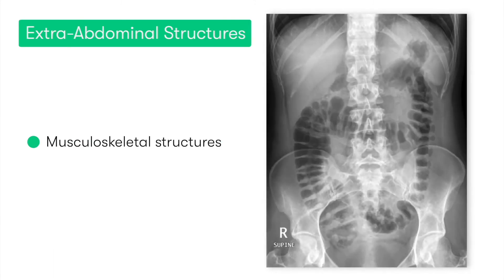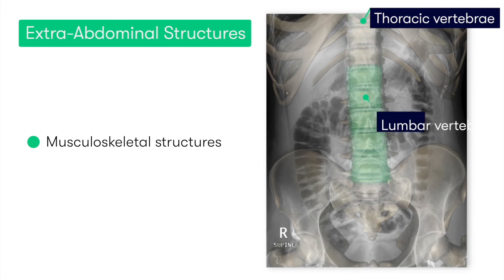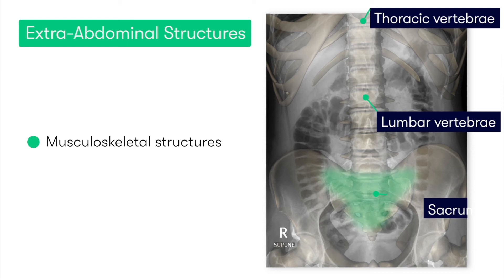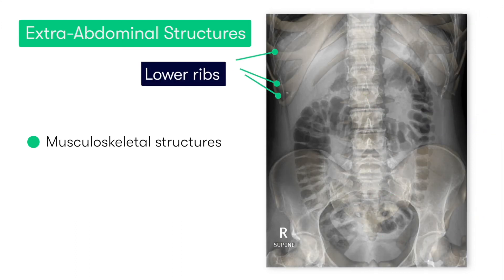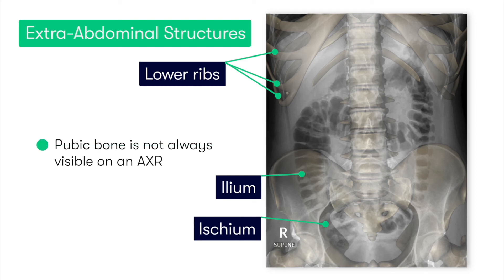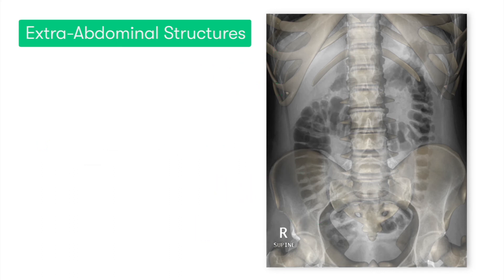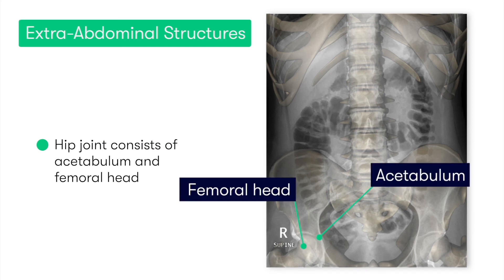Moving on to extra-abdominal structures, these are essentially musculoskeletal structures, which include the thoracic vertebrae, the lumbar vertebrae, the sacrum, and the coccyx. We can also identify the lower ribs and the bones that make up the pelvis — the ilium, the ischium, and the pubic bone, which isn't always easy to visualize on the abdominal x-ray. And finally, you can see the hip joint, which is made up of the acetabulum and the femoral head.